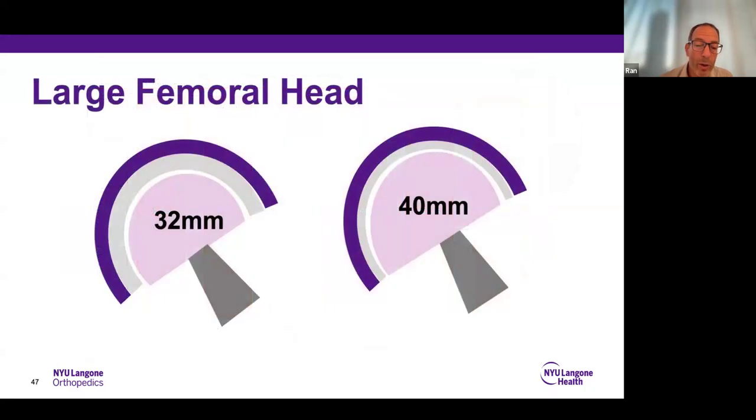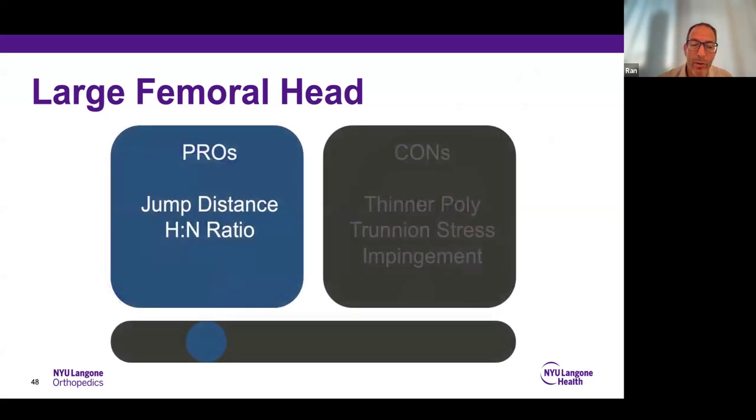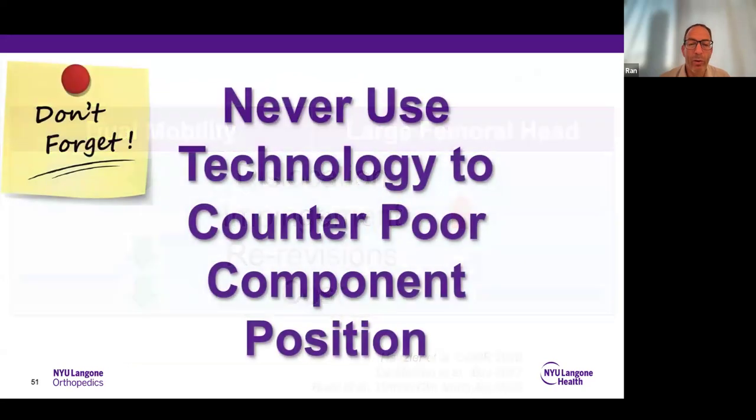If you have options when you do hip replacements, use a larger head. All the data point to less dislocation and no other downsides for it. When you do hemiarthroplasty, you can't really play. There's one appropriate head for that native acetabulum. That's important. So larger jump distance. The cons for large heads have not stressed out anymore with modern things. So less dislocations with large heads.